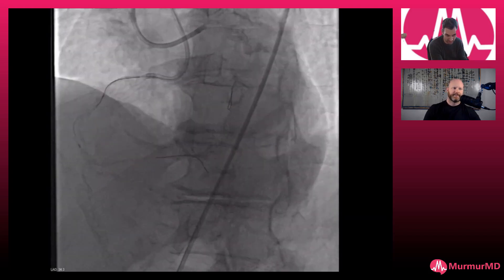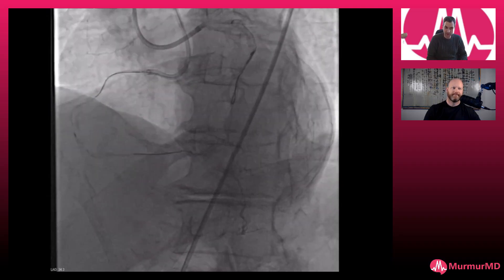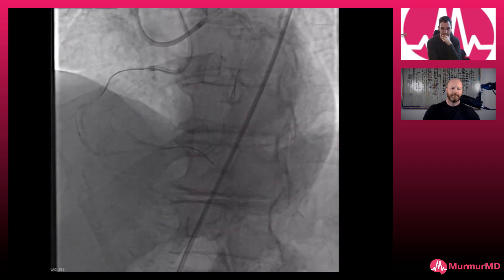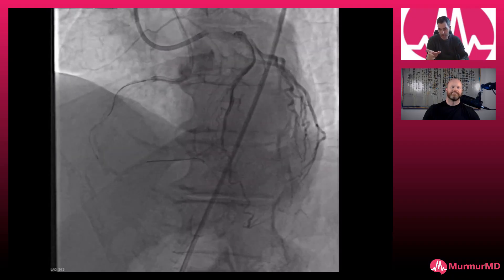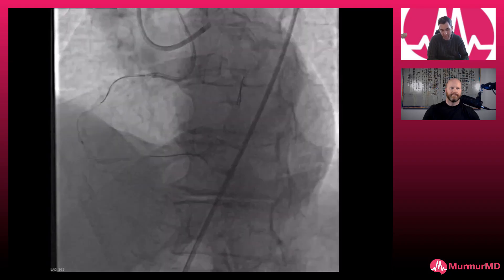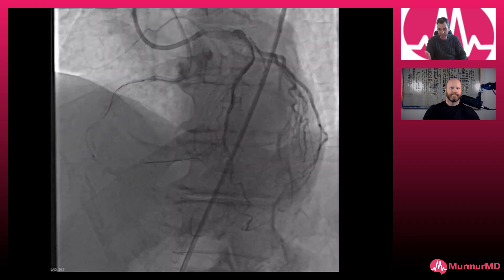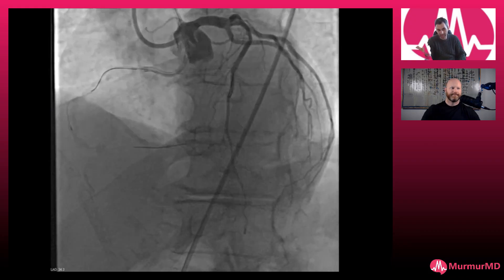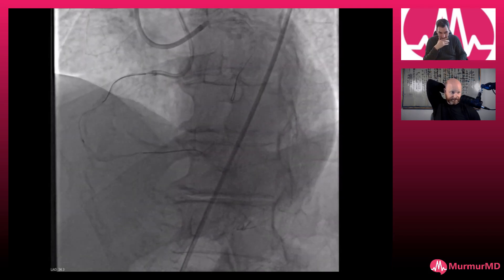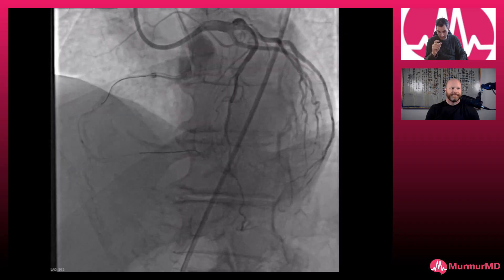Distally it looks like you're in. Yeah, for sure. You're completely right — we don't know when we've crossed intraplaque or extraplaque. There's data showing that if you ask operators, they can be wrong in any configuration. You can think you crossed true and you were out; you can think you went out and you were true the whole way through. The first clue you'll get is how the microcatheter is going to behave when you're trying to drill it through, and then definitively you'll find out once you do the imaging. Based on this picture, I suspect that if it is extraplaque, it's a very, very short portion.